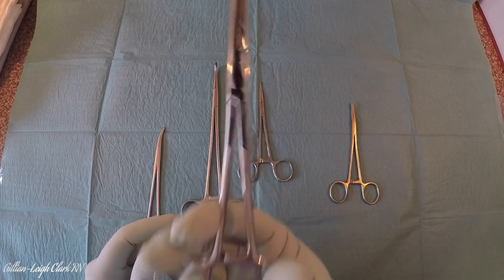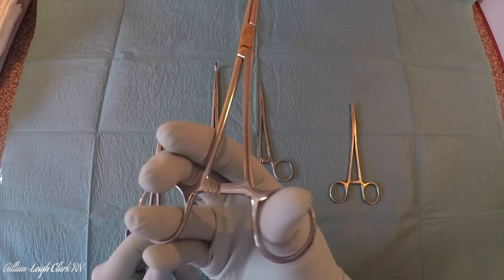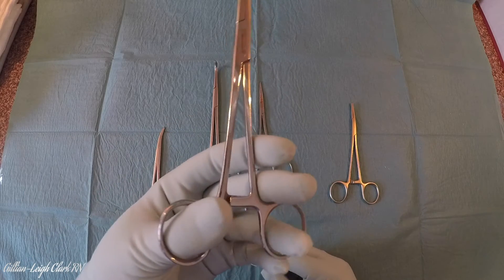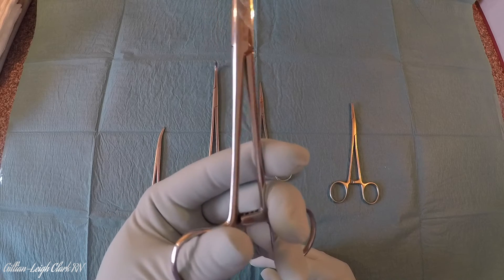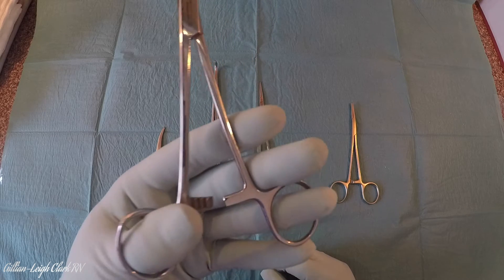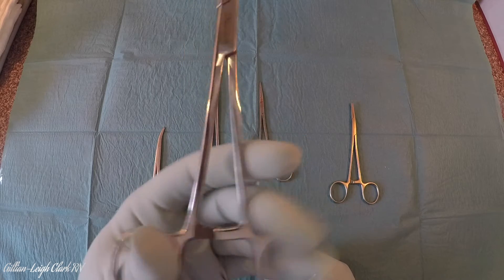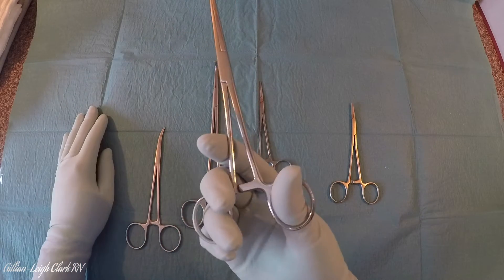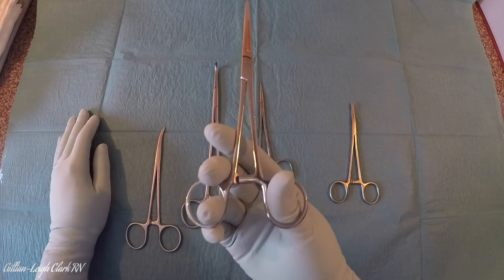Most instruments are right-handed, which means that when you squeeze them together and push forward with your thumb, it undoes the ratchet. This is quite a tricky skill to master with your left hand, because the non-dominant hand is working a right-handed instrument. You have to squeeze it together and pull your thumb backwards, which is an unnatural motion, while pushing your fingers forward. It does take some practice, and it is absolutely possible to master it — but bear in mind, it's not what it's designed to do, so it is always going to be tricky.